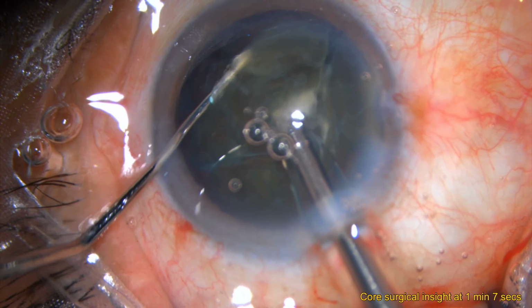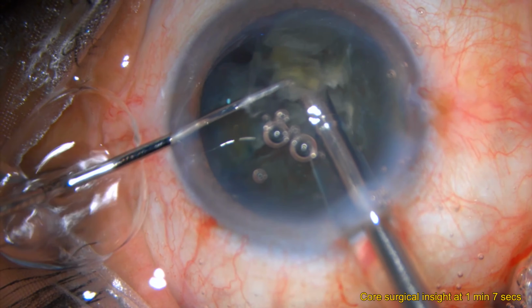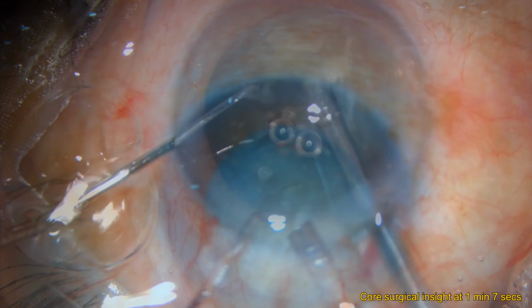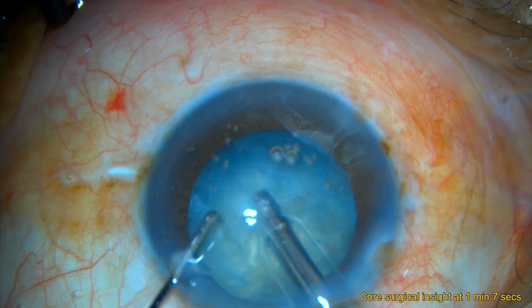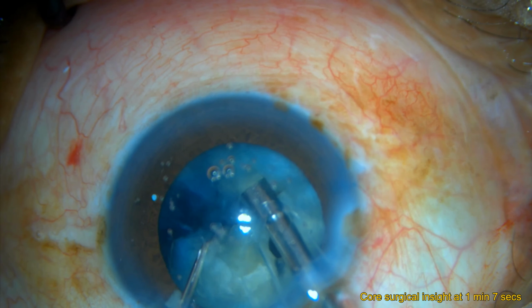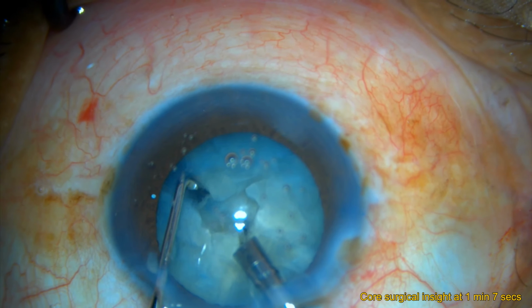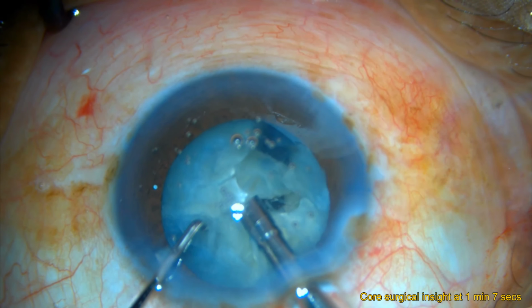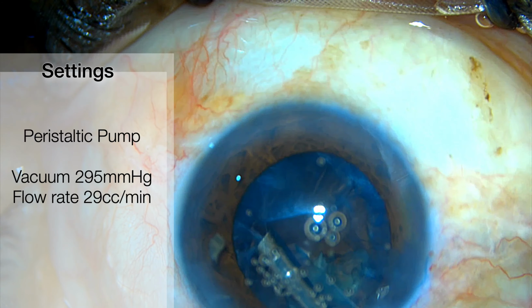So think of it like driving. Yes, someone speeding at 150 km per hour is definitely dangerous, but so is an Alto doing 30 in the middle of a 6-lane highway. Once you are at the transition from beginner to a competent surgeon and your foot control becomes increasingly precise, exploring higher vacuum and flow rate becomes not just safe, it becomes essential to efficient surgery. So here's a small moment from a real case that I'll be showing you to make my point.